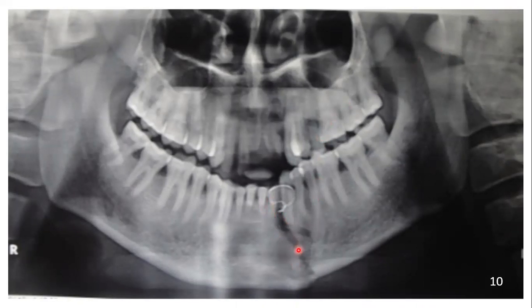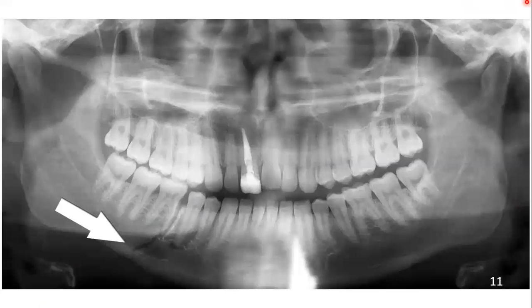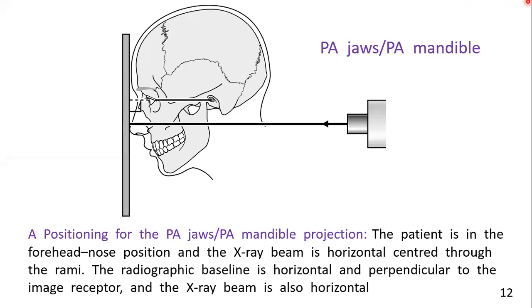Now a fracture in the parasymphysis area in OPG. Here again you can see a fracture in the body area — a complex or multiple-line fracture, indicating a segmental fracture.